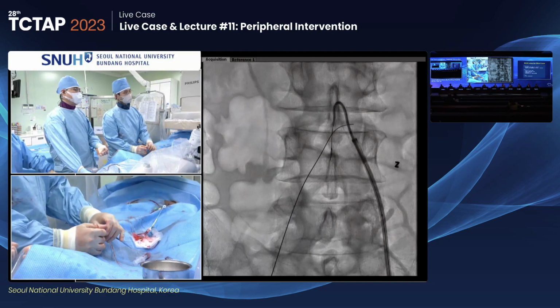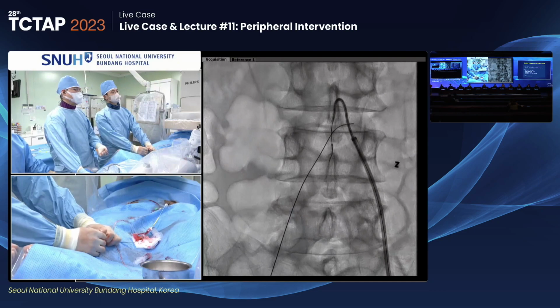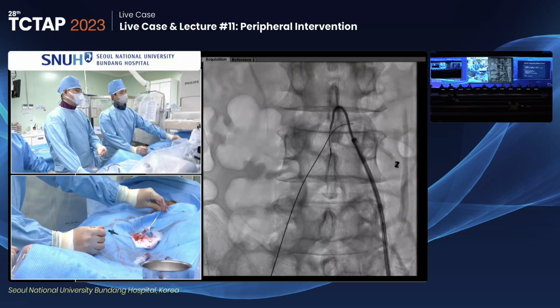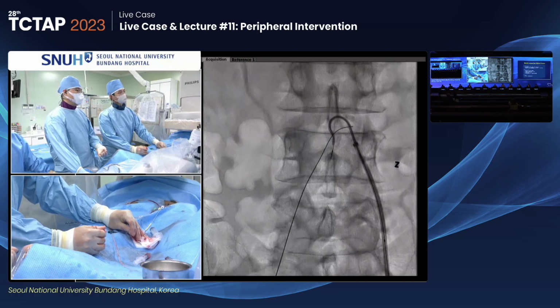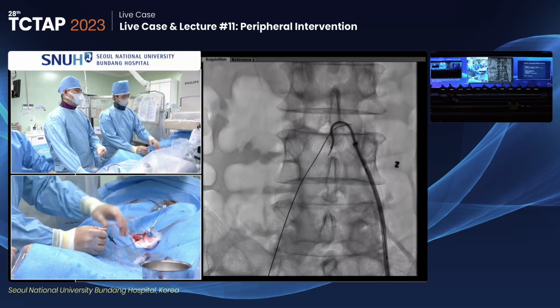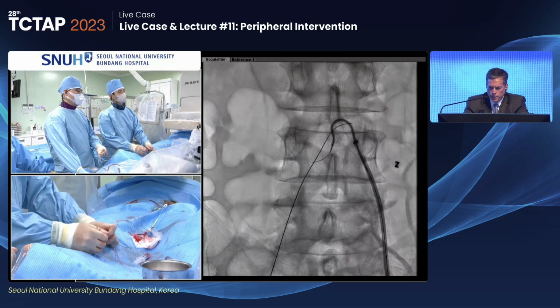That's right. But I think this is not the center of the proximal cap. And more down of the omni catheter can make a more centered wiring. Yes, there you go. Try redirecting. Yeah, that seems to be better. Okay, more down, and I think the direction can be more exact. Good. In the United States, they had this thing called the Houdini catheter, which was an invaginated balloon that tended to draw the thing into the center of the lumen.